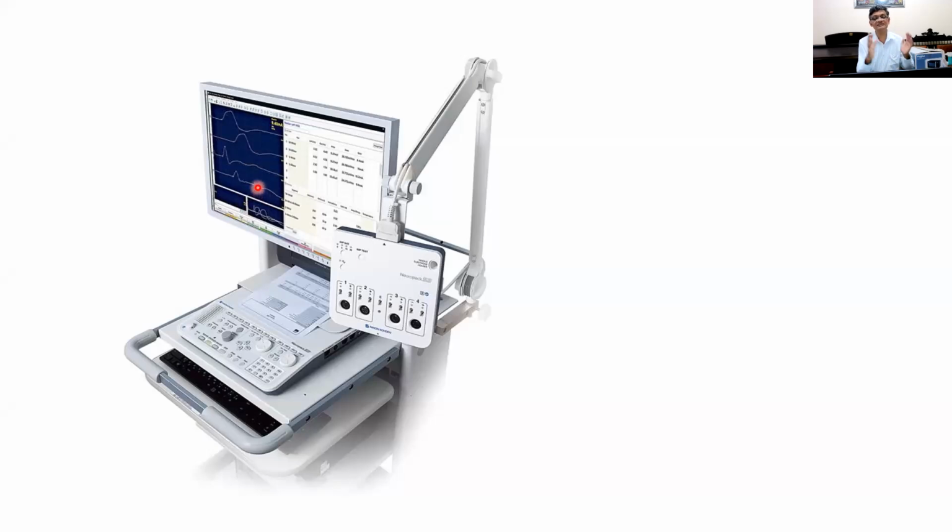And then using this information, you calculate the motor conduction velocity of the median nerve and of the ulnar nerve, and you have the values for the distal latency of the median nerve and the distal latency of the ulnar nerve. Using this information, you make your diagnosis.